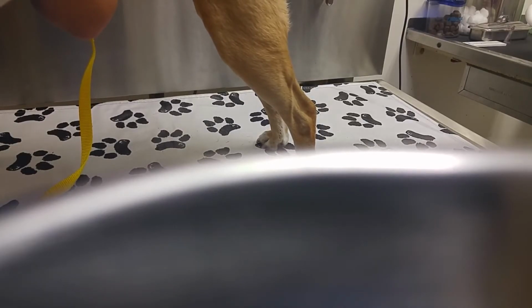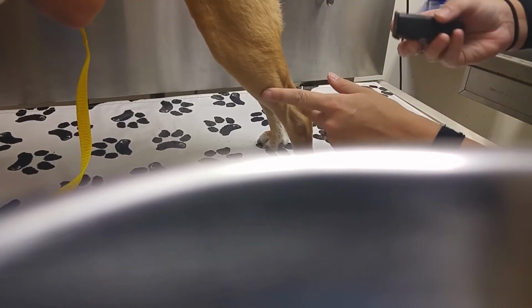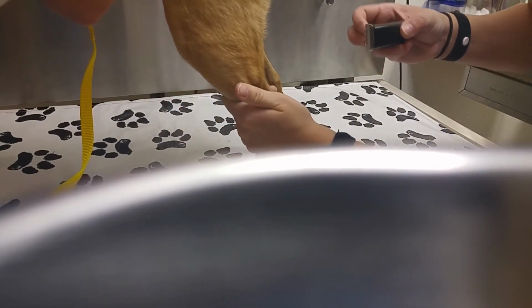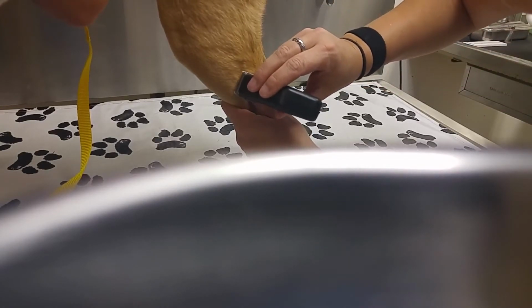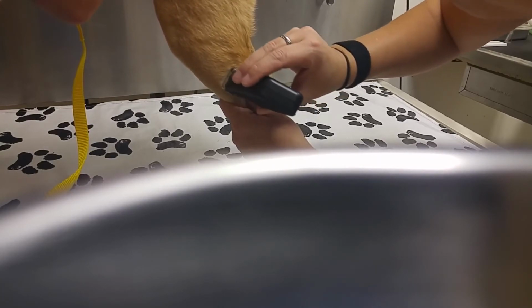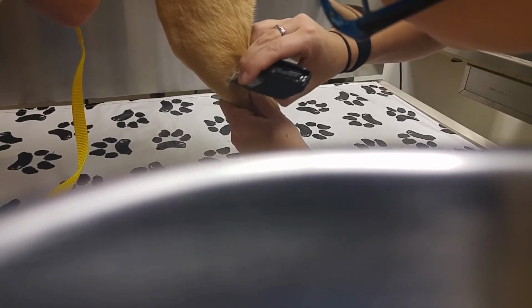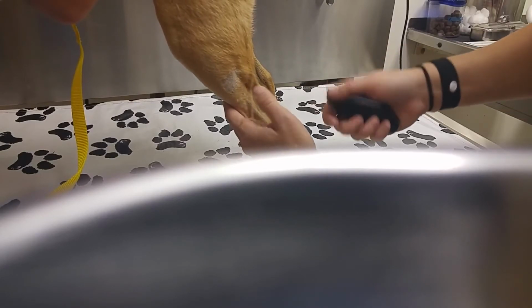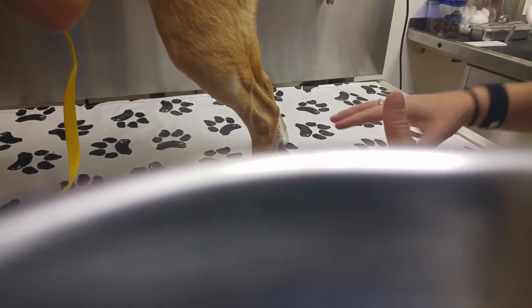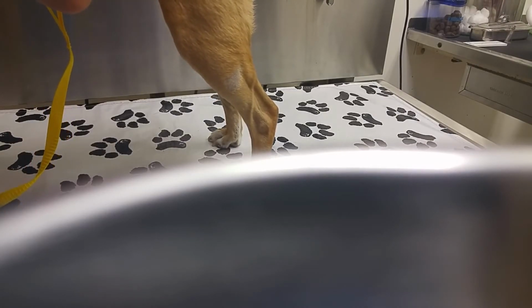Alright, we're going to go ahead and do a skin scraping on this dog. I'm going to just shave a little area right here, so I can get a clean scraping without a whole bunch of hair included. You can see me shave the little spot. And then I don't want to clean the area, because then I may be getting rid of some type of organism that I need to be catching.